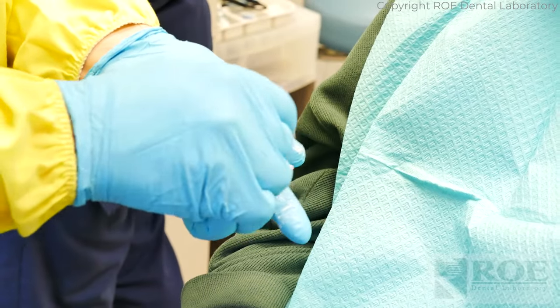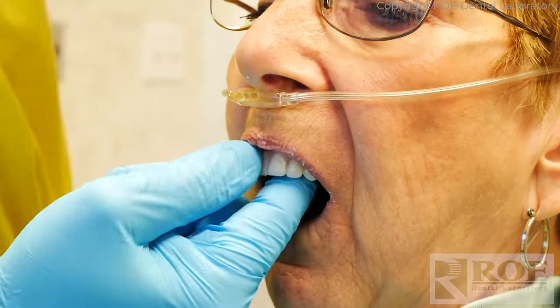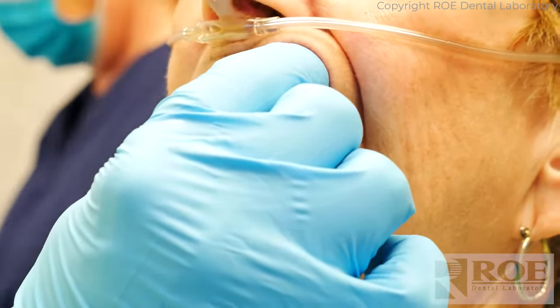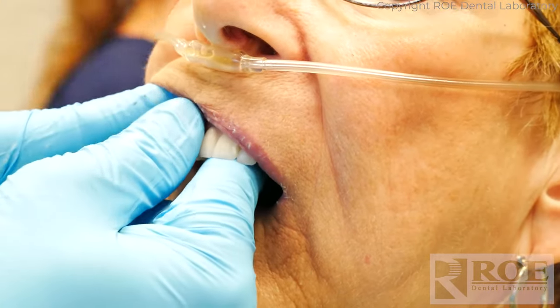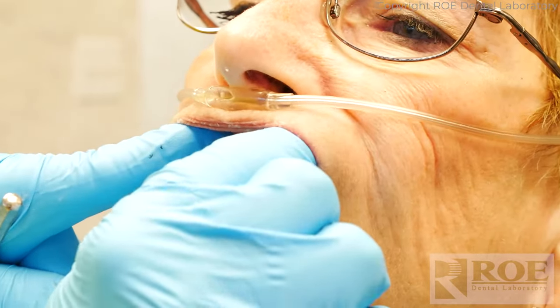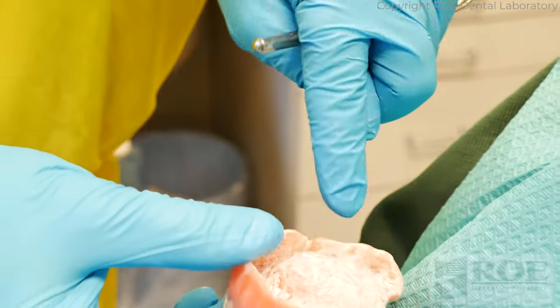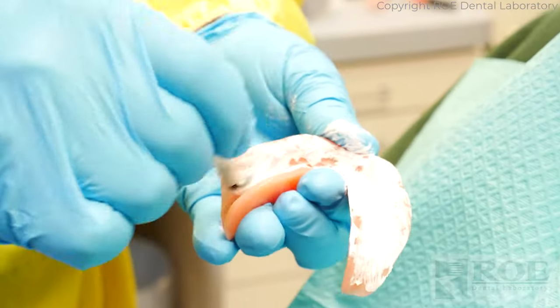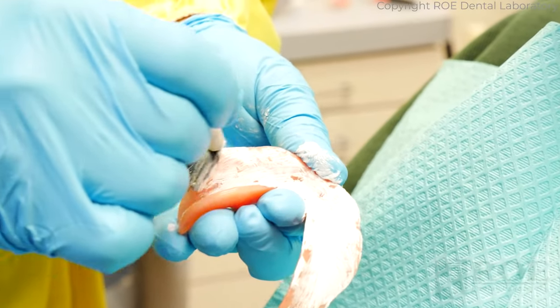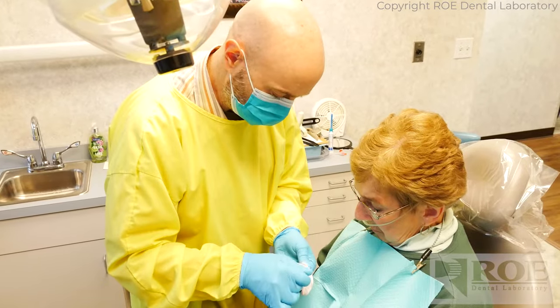You love that — I love when the patient's engaged. You're perfectly positioned. You're going to feel me pressing. Head back if you can, because I don't want to stress your neck. You're not feeling anything, are you? Wonderful — you know what that means: the lab made a beautiful impression and this gentleman and his team did a beautiful job processing your teeth. Look at the suction — you see those two, and same thing here, and same thing right here. Some people you look and say they can't imagine she has that much attached tissue, but she does — meaning your gums are better than the original dentures showed us.